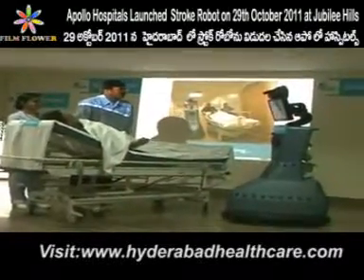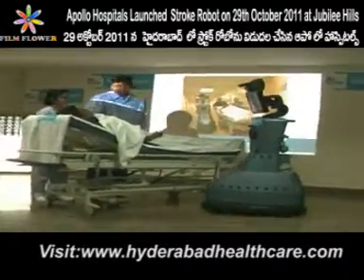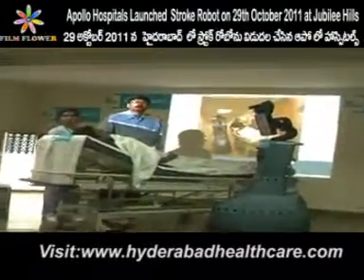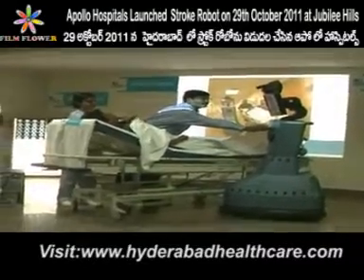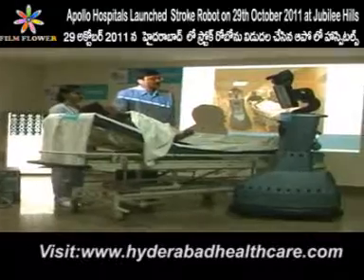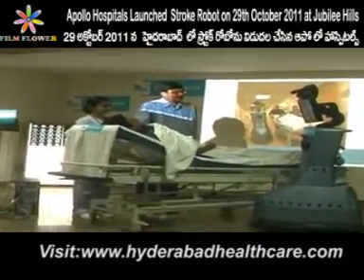Good morning, Doctor. I am Mr. Reddy. Please hold the mic in your hand. I am Mr. Dave Spoli. Around 10 o'clock, when you were working in the office, it started with left-sided symptoms.